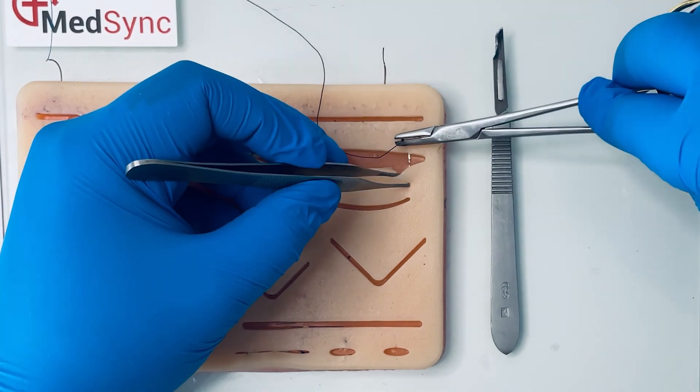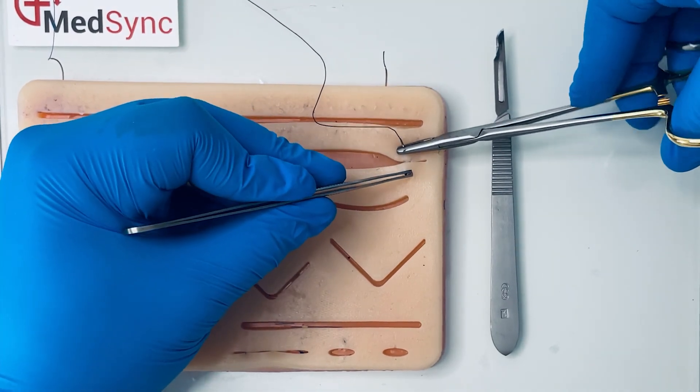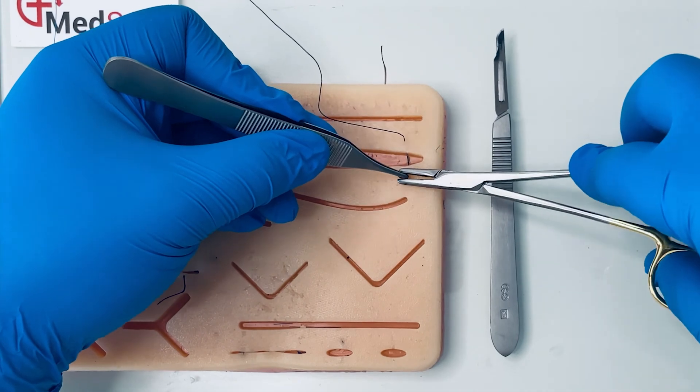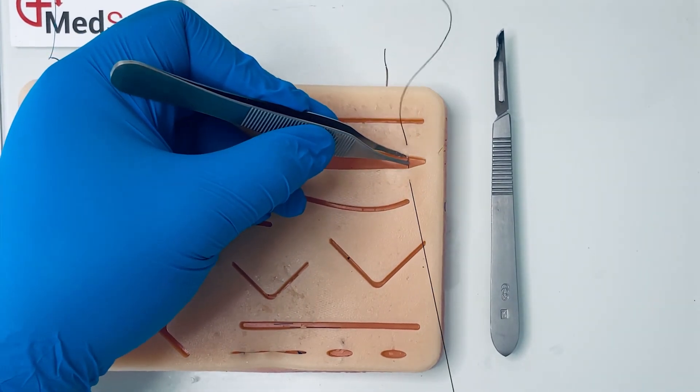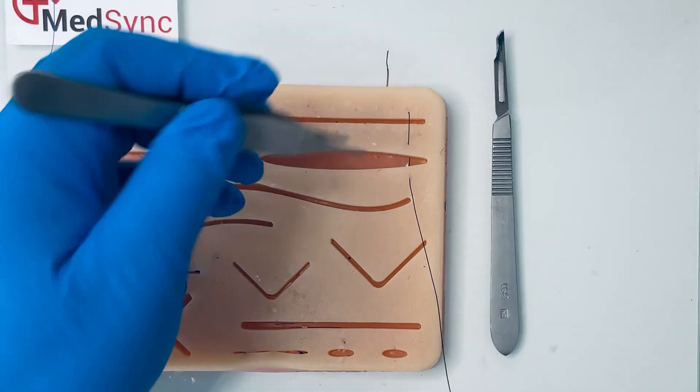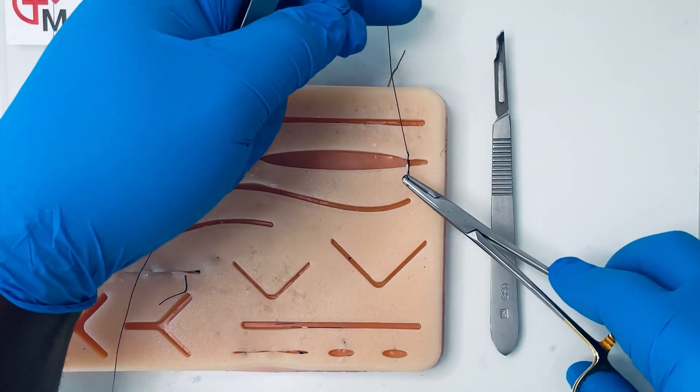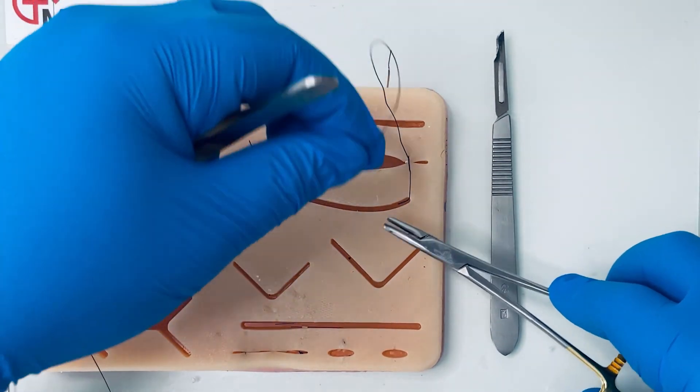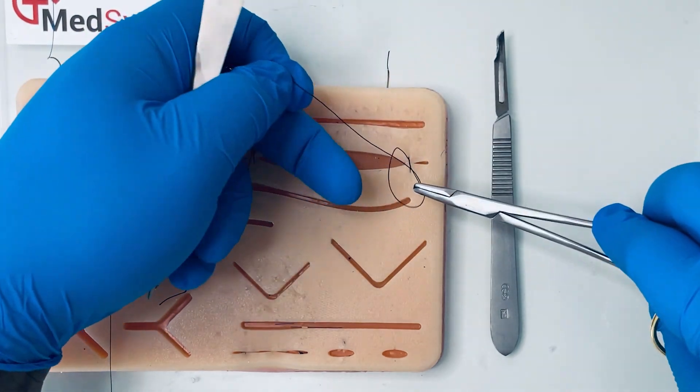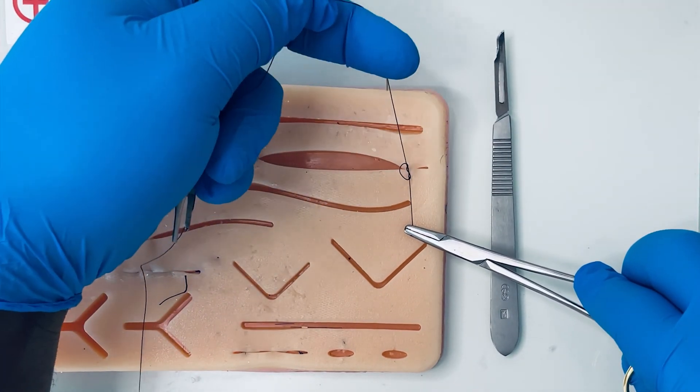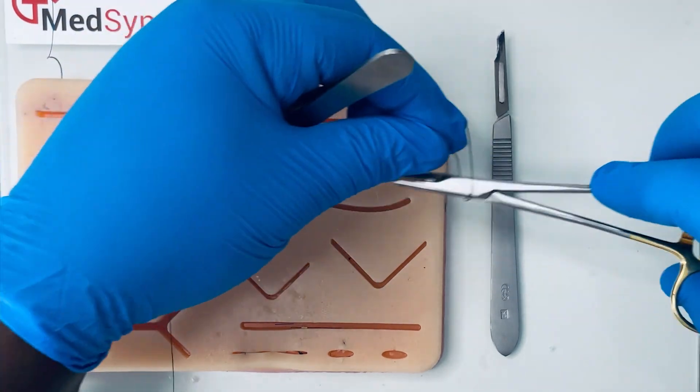In the first technique, after you have tied the first knot, the surgeon's knot, ensure to keep the short thread short. You then throw a reef knot but you do not alternate the position of the long and the short thread. Instead, as you bring the short thread through the loop you apply tension only to the short suture until you have the desired wound approximation.